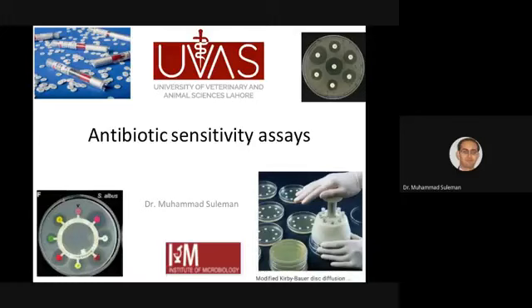In this very first slide, you can see from the beginning, from the left-hand top side, these tubes that you see over here contain the antibiotic discs. हर ट्यूब जो है इसमें एक पर्टिकुलर डिस्क होती है. There are around 100 discs in each tube, and these small filter paper discs contain a specific amount of antibiotic like penicillin, amoxicillin, ciprofloxacin, different antibiotics होती है. And the idea is to place them on a certain media full of bacteria जो आपने isolate किए.